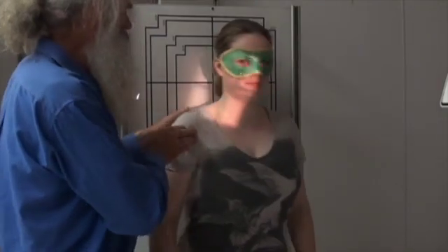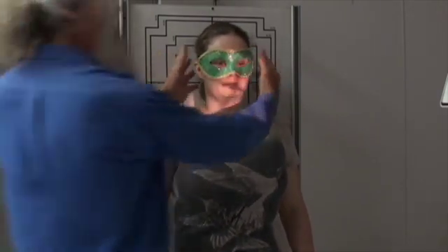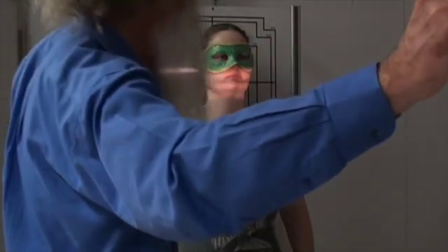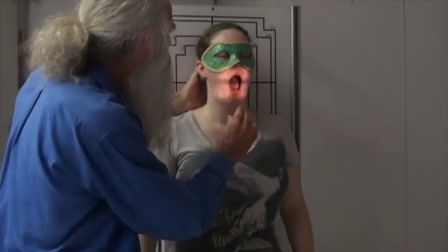We then go into the open mouth position. Generally it's about 15 degrees between the eye and ear line, so I turn the hood up just a tiny bit and go out wide. The collimation will be about that size — the top will be just above the teeth. We collimate in, open the mouth very wide, and make sure we're in the middle. The only reason for a wider view is for a chiropractic series where they might need to see the mastoid air cells behind the ears. That's your basic five-film series for a cervical spine.